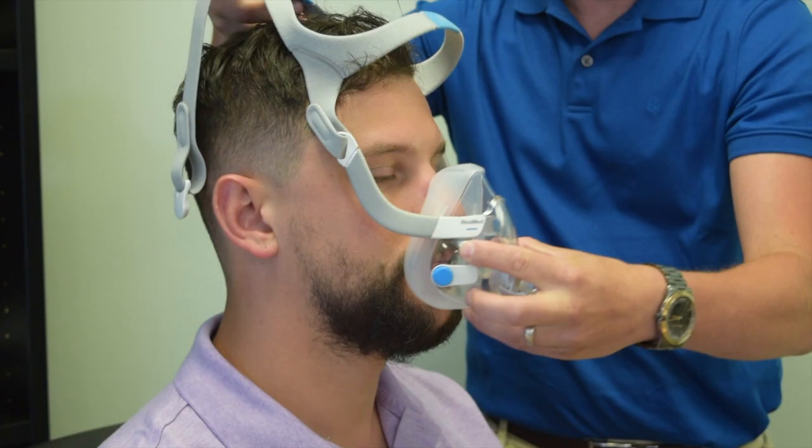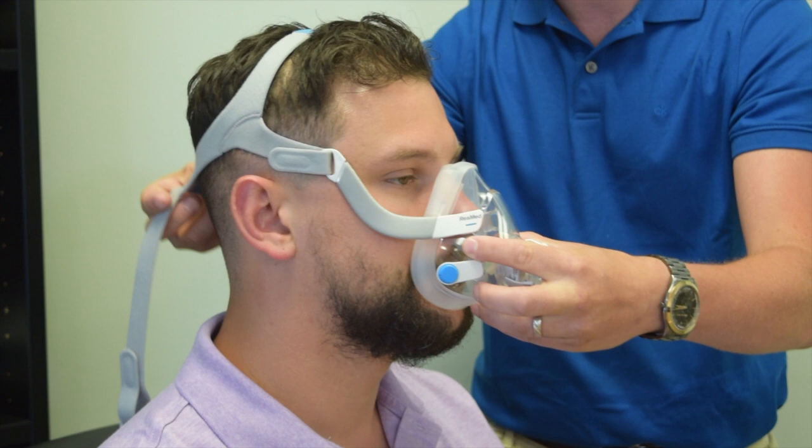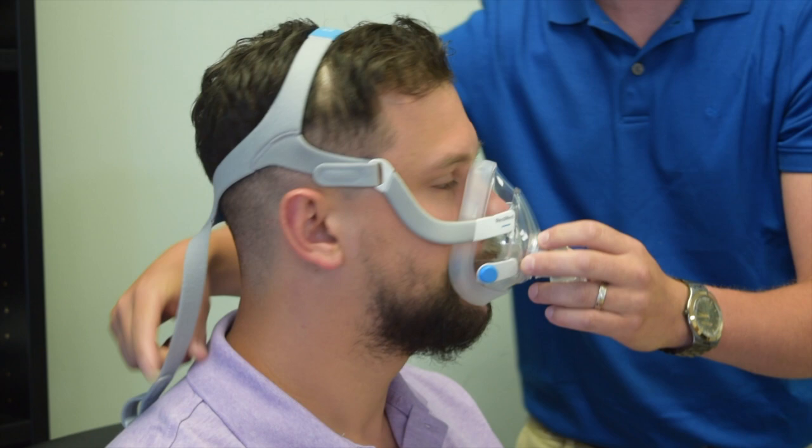To fit the mask, place the cushion over the mouth and nose and slide the headgear towards the back of the head. Once in place, you can then connect your magnets by pulling the straps underneath each ear.